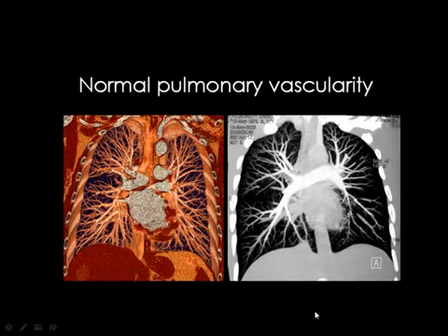Then can you imagine that this is a CT scan of the chest, and you inject the patient with contrast material and let the machine scan for the pulmonary artery, what we call CT pulmonary angiography. And you just tell the machine, I am looking for the pulmonary artery, and the machine knows the time between the injection in the antecubital vein and reaching the pulmonary artery.